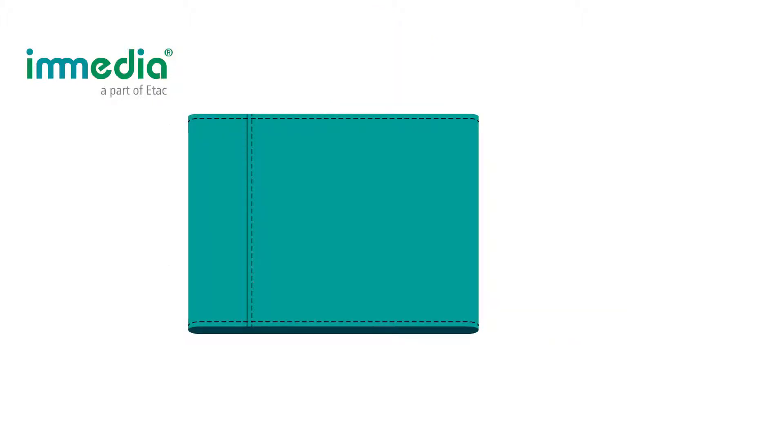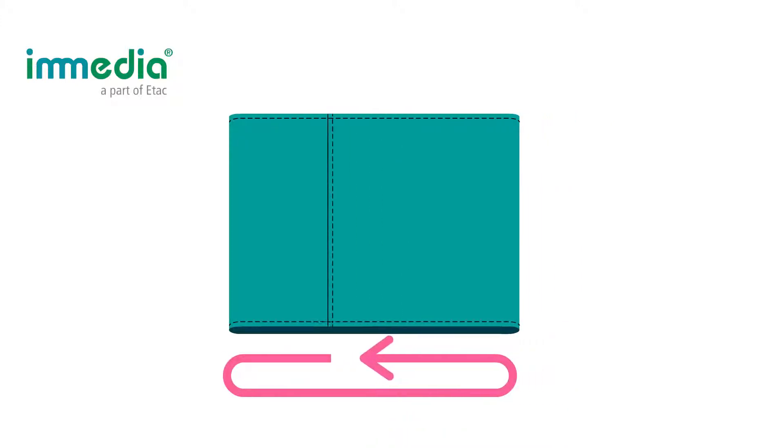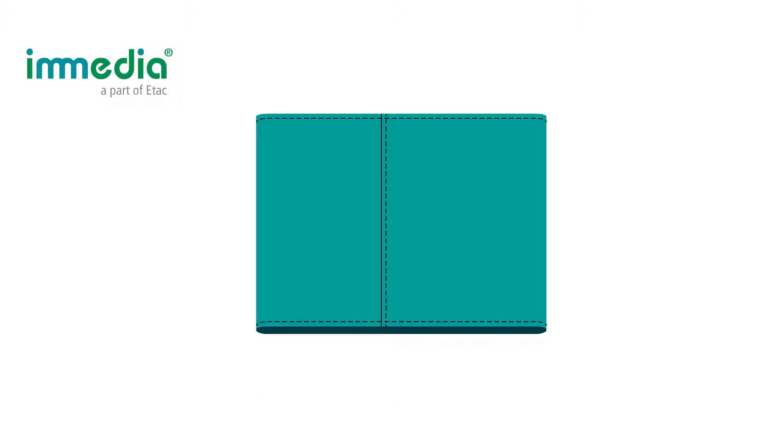Inmedia Multiglide is a thin, tubular slide sheet with ultra-low friction. When the tube is rotating, the movement occurs. The interface between the two layers of the fabric has very low friction.